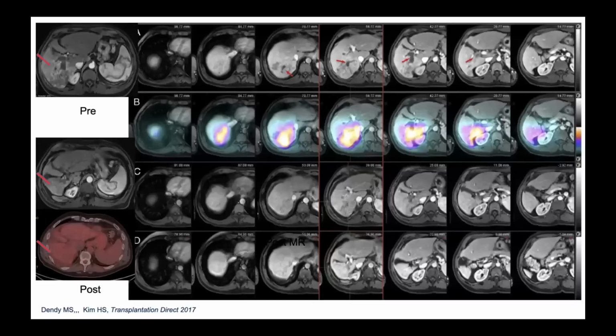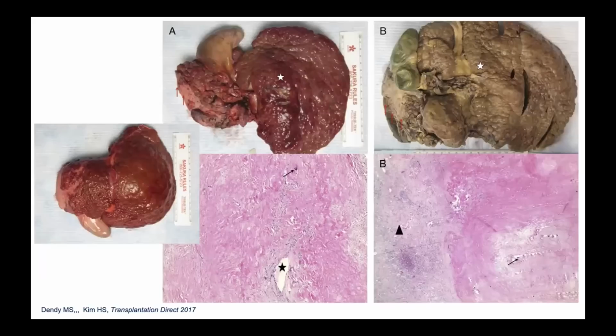So this is a patient, at the top pre-op and at the bottom post-op, an infiltrating PVT advanced stage patient that I treated a while back with Y90 radioembolization. As you can see, the tumor has responded to the Y90 radioembolization treatment enough such that after 2 years of careful watch, we actually transplanted this patient. So you can see an advanced stage BCLC C PVT patient getting transplanted. It was before the IO time, so it was actually quite tremendous. We learned a lot from this case, that even an advanced stage patient with the right kind of treatment could potentially be saved and cured.